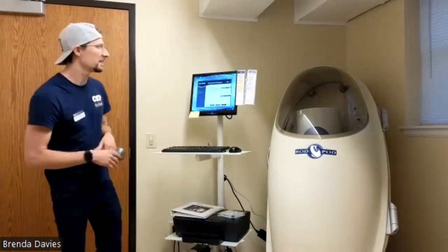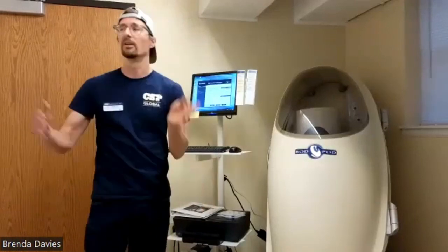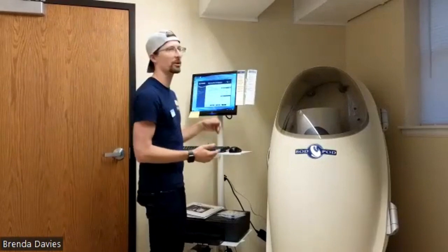So the next piece is making sure the client is getting ready for the Bod Pod assessment. So if you feel comfortable getting into this spandex layer, that's the appropriate clothing.